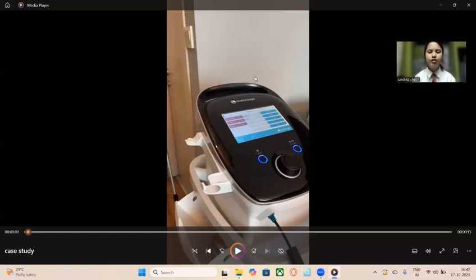This case study shows a physiotherapy session after a limb lengthening procedure. The goal is to reduce pain, stiffness, and swelling using ultrasound therapy. Ultrasound waves are applied to muscle around the lengthened limb. This helps to increase blood flow and speeds up tissue healing. During each session, the therapist moves the ultrasound head in circular motion to cover the treatment area evenly and avoid hot spots. I'm going to share it again so that you can see how the physiotherapist applied the ultrasound head in circular motion.